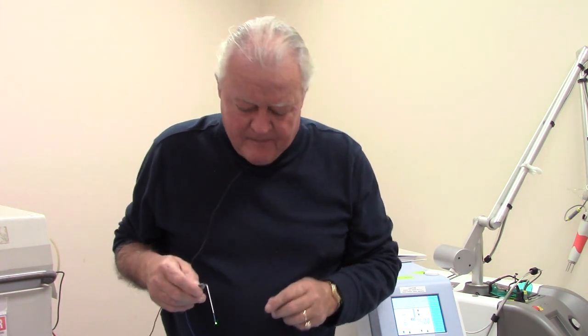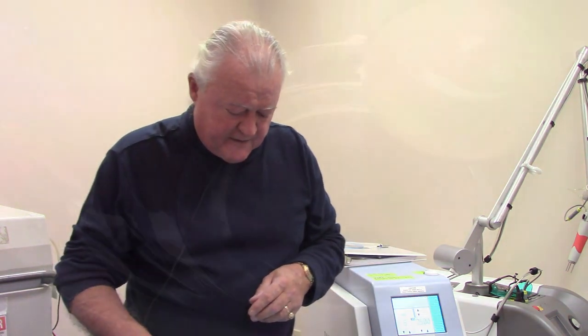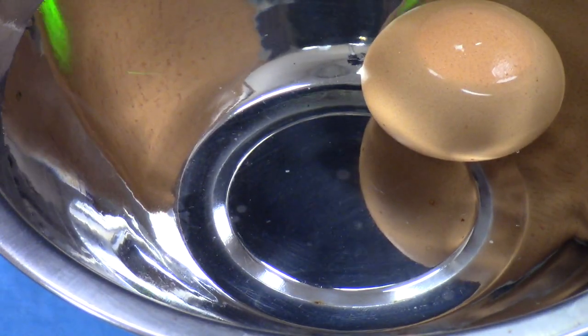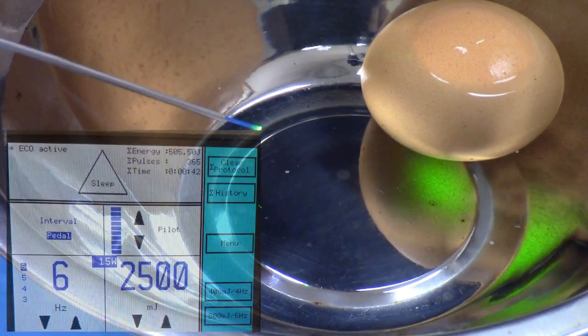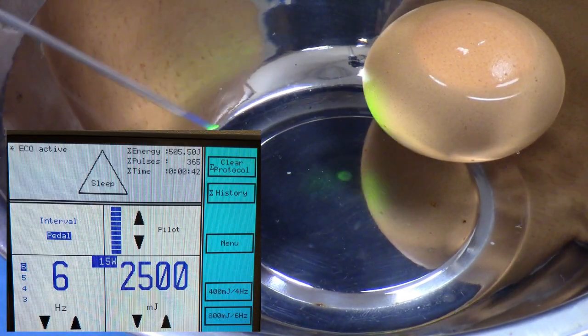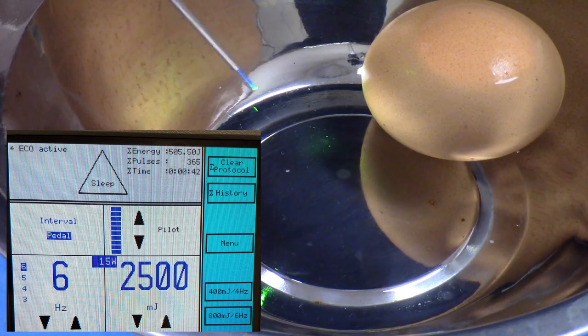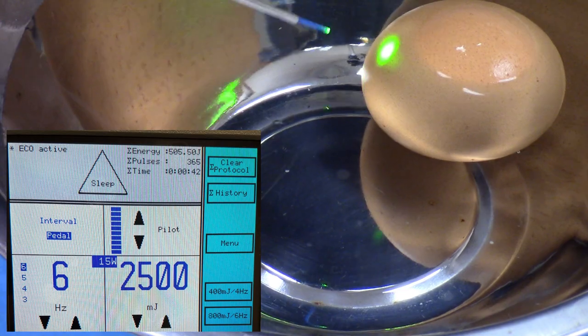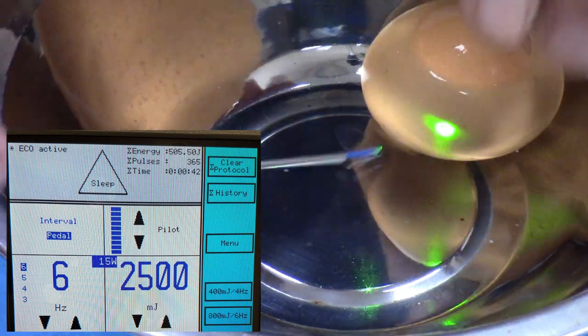Let's fire this up and start to look at these effects. I have the laser set to give you a photoacoustic effect, a high concussive effect. It's set at 2500 millijoules or 2.5 joules at six times a second. That results in an average power of 15 watts. Remember, it's the joules of energy that really does the work, not the average power.